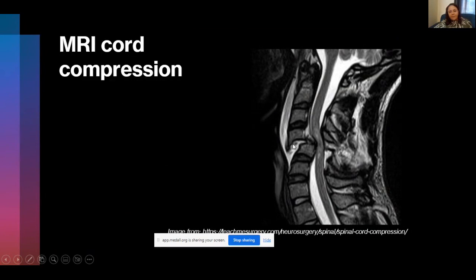That's an example of a cervical spine MRI in a patient with spinal injury. That's a fracture dislocation of the cervical spine. That's the cord. See how clearly we can see the cord on the MRI. We can clearly see that this fracture is compressing the cord. If you look carefully, you'd find that this part of the cord looks different than this. This is brighter, more white than the adjacent cord, and this signifies that there is cord edema and cord injury here. These signs are never that clearly obvious on CT and never, of course, on X-ray. So MRI is very useful in evaluating cord injury and spinal injuries.